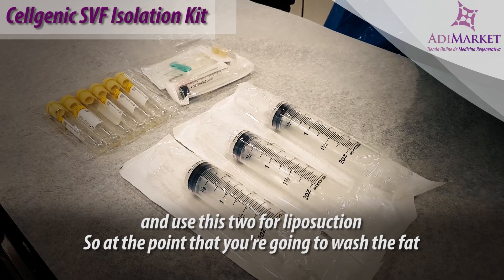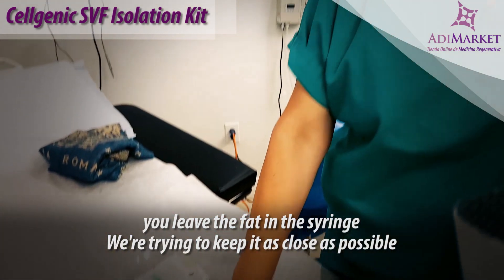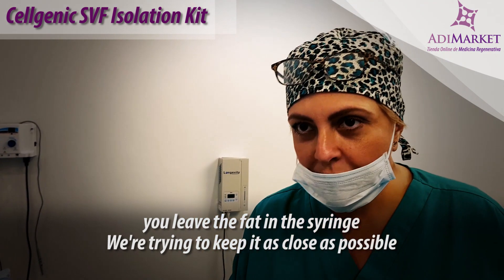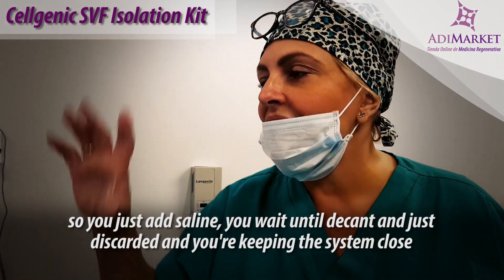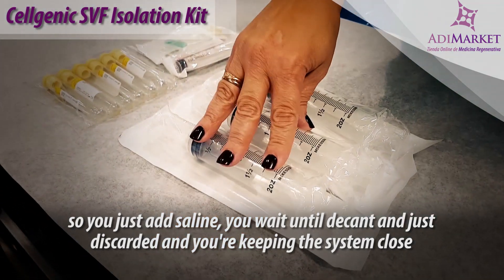At the point that you're going to wash the fat, you leave the fat in the syringe. We're trying to keep it as close as possible, so you just add saline, you wait until it settles and just discard it, and you're keeping the system closed.